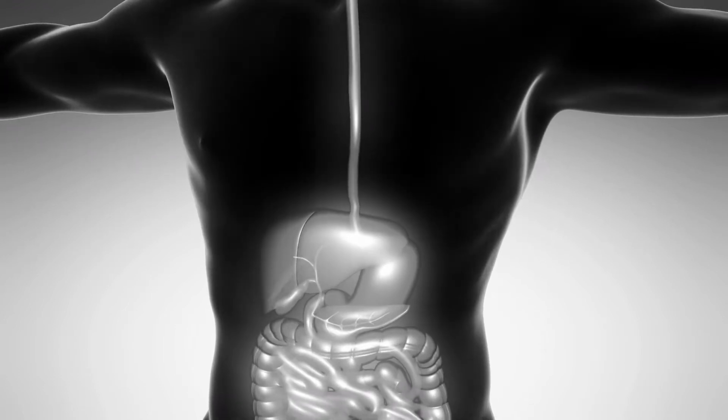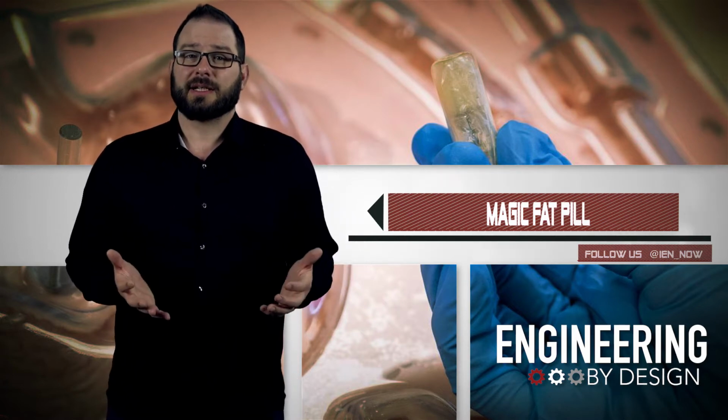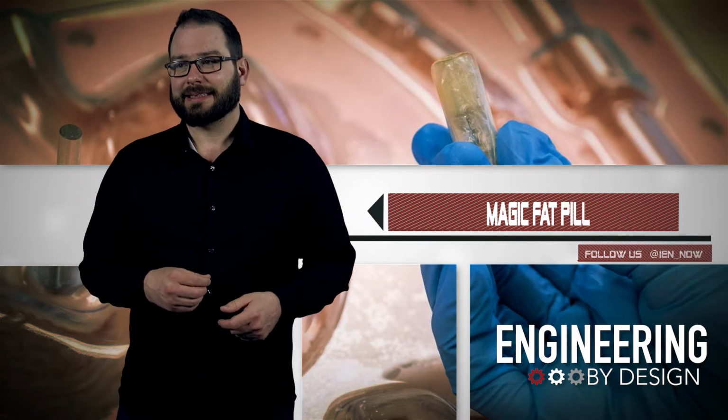First, they need to make sure that the balloon can be naturally decompressed and expelled by the body, before testing the capsule for its efficacy. Gotta make sure it gets out of there.